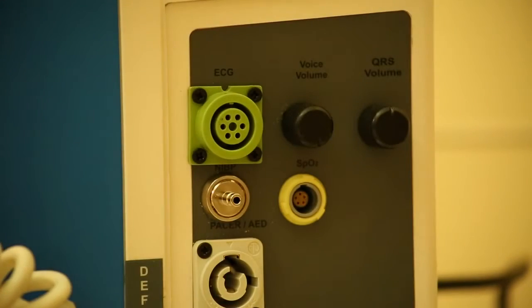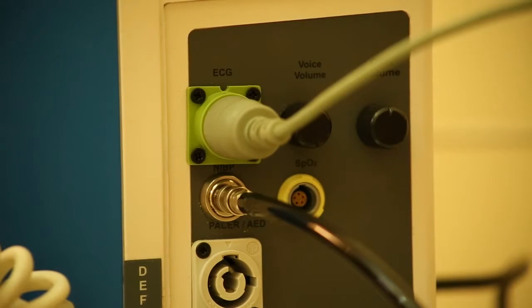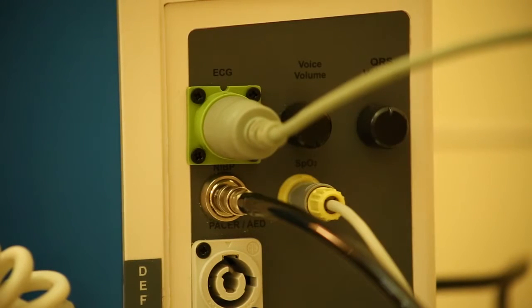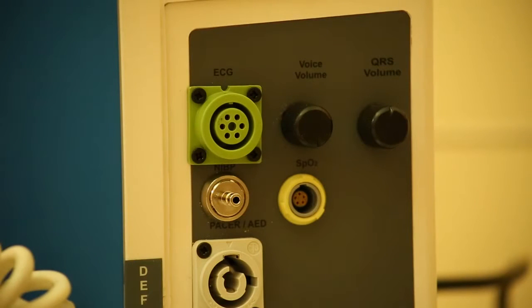The side panel of the unit has various connectors, which are ECG connector, NIBP connector, SpO2 connector and the pacer connector. The side panel also has 2 volume knobs. One knob is to control the volume of the voice prompt. The other is QRS volume control. It controls the volume of the heart rate beep sound.